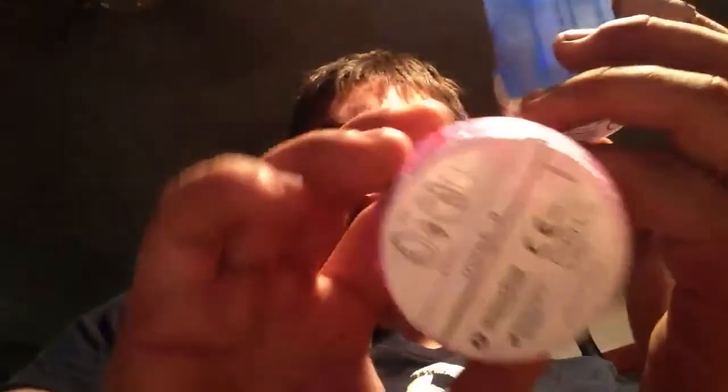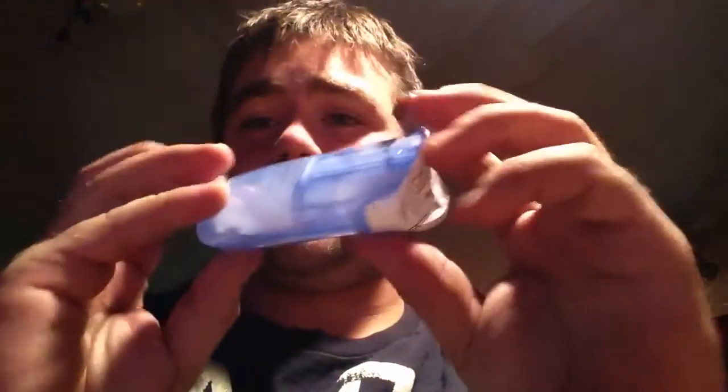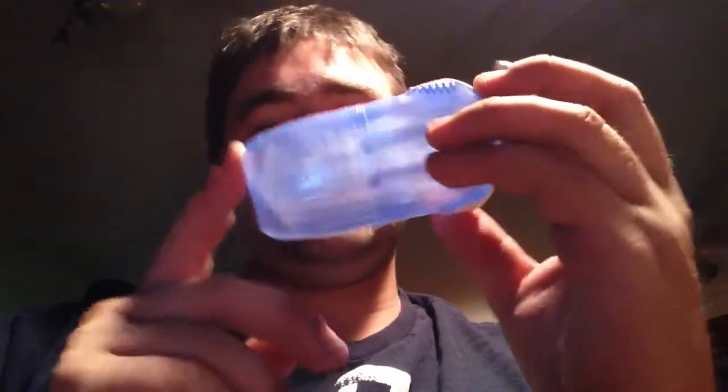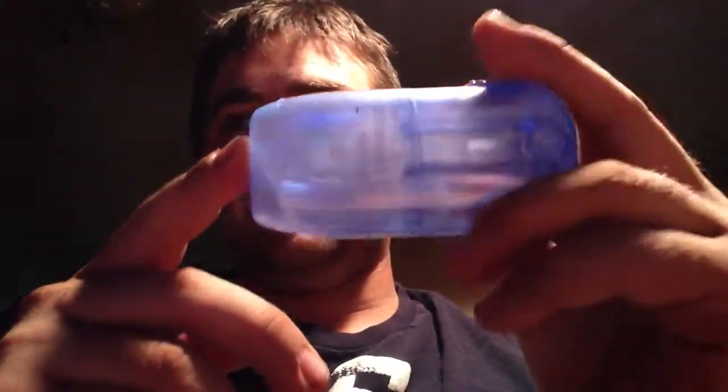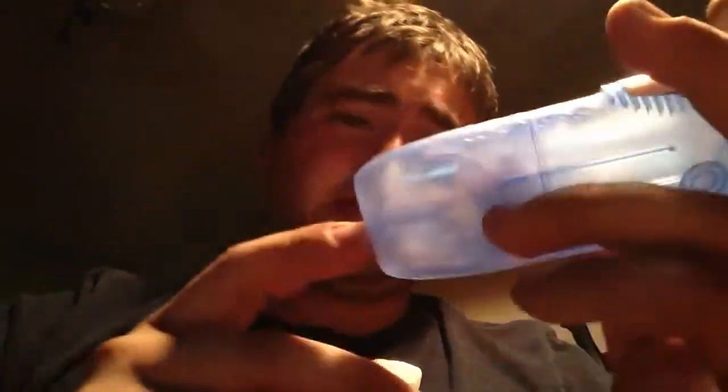So today I'm actually going to use this one, mostly because this is the kind that I normally get. This one's a little pink. Again, the pink ones are from my good friend Kate. It's a little plastic thing designed to be pretty safe. There's a needle in here, and the little site has a cannula on it. It's a medical grade plastic, pretty much. I'm not exactly sure.